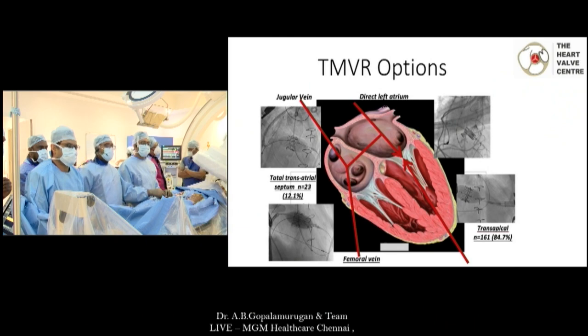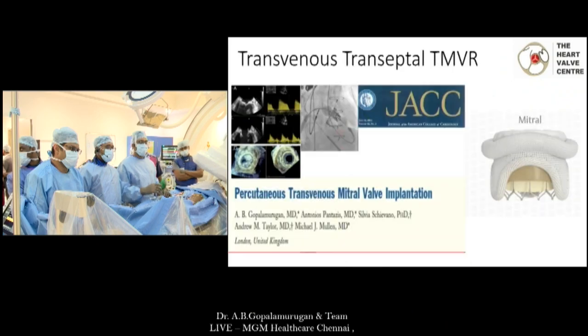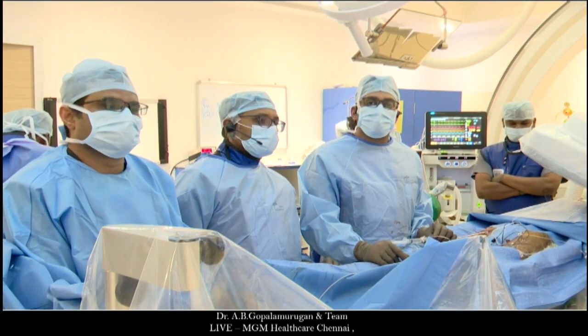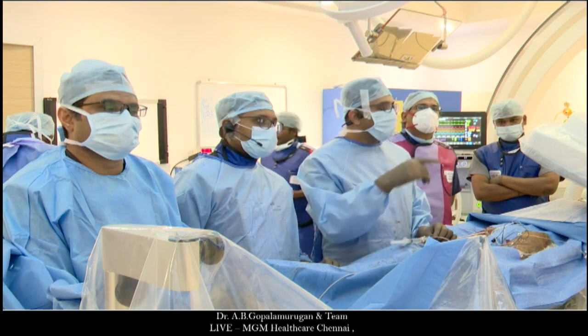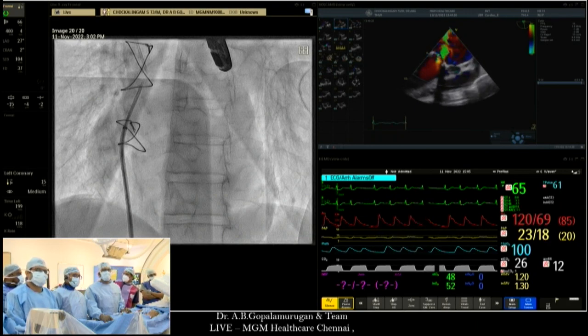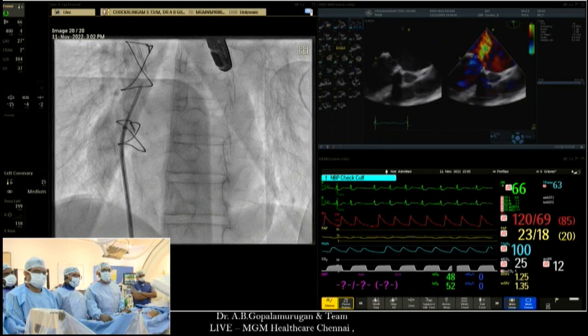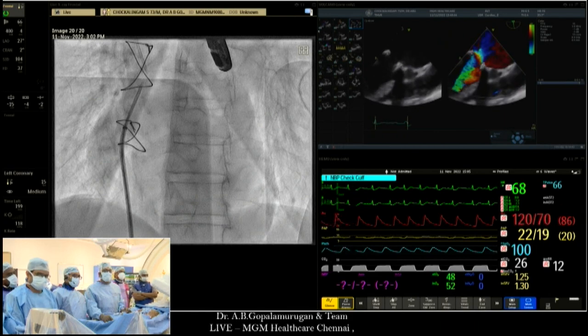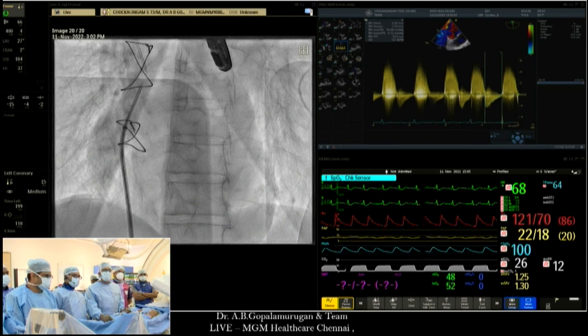With this, we have two venous accesses, a radial artery, and we are trying to take a septal puncture under transesophageal echo guidance. You've seen the CT. Essentially, we have a 29 Biocor in the mitral position that has failed, leading to severe MR. Can you show the echo, please? Great. You can see the echo, and there is severe MR. He's NYHA class 3. He needs a redo mitral valve. We've decided to proceed with a transcatheter mitral valve-in-valve via transseptal access. This is a 29 Biocor, so the inner diameter is 24-25. We are planning to use a 26 Sapien with a transvenous transseptal access.